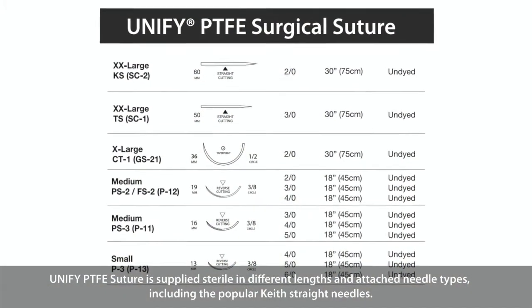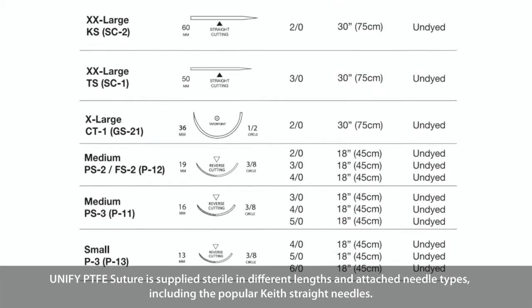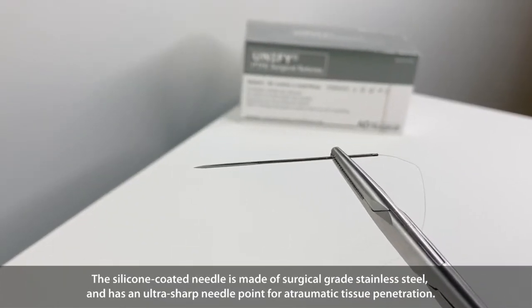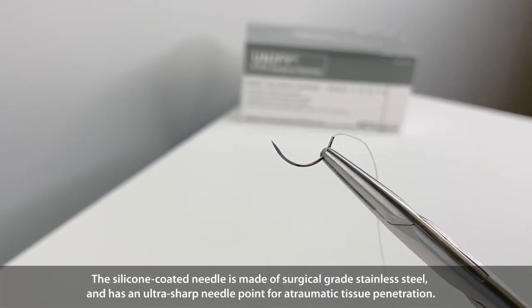UNIFY PTFE Suture is supplied sterile in different lengths and attached needle types, including the popular Keith straight needles. The silicone coated needle is made of surgical grade stainless steel and has an ultra sharp needle point for atraumatic tissue penetration.